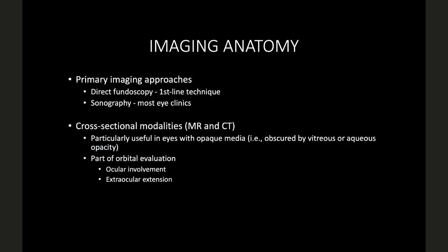And when you get an MR, it's always with and without contrast. Okay? This is another rule of thumb. When you guys get an MR, most often when you're looking for abscess or tumors or subtle inflammation, you need to see how the enhancement pattern is. You cannot just get a standalone MR with only. The only time they get it is because they got an MR without, and then they want to have additional stuff, and it's a short-term interval follow-up. So unnecessary laying the patient down for 20, 30 minutes, just go get an additional post-contrast. That's the only time usually you get, unlike a CT, okay? So in CT, choose with or without, but an MR, better to get with and without, okay? And this is just the rule of thumb.